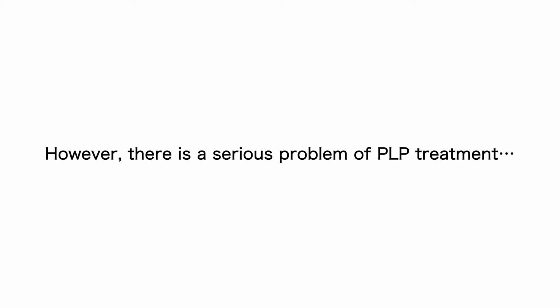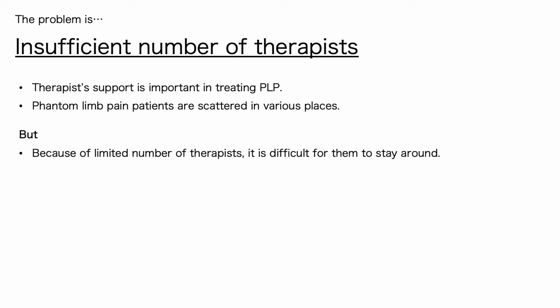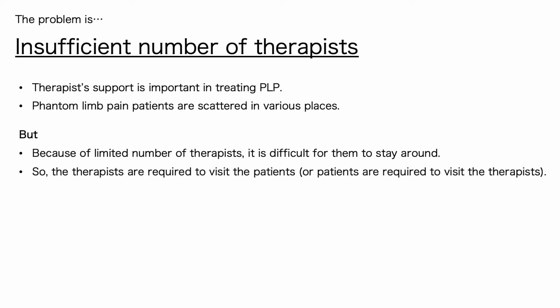However, there is a serious problem of PLP treatment. The problem is insufficient number of therapists. In treating PLP, the therapist's support is important, and phantom limb pain patients are scattered in various places. But, because of limited number of therapists, it is difficult for them to stay around. So, the therapists are required to visit the patients or patients are required to visit the therapists. Sometimes they are forced to travel long distances, which make them struggle.